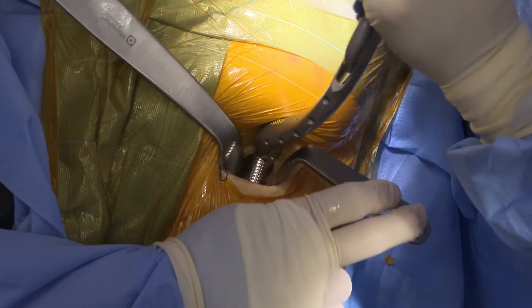The straight anterior approach is already good because we're not cutting any muscles, but in order to get visualization to prepare the acetabulum and then prepare the femur, we had to make a fairly long incision down the thigh. By using the cannula, the distal half of that incision we don't need anymore because we're using a percutaneous route through the subcutaneous tissue — so we save that incision and save muscle dissection. You can make your incision in a spot less likely to involve branches of the nerve we're trying to preserve, and it allows us to see the femur better so we can still do all the same releases, just in a better way, and insert our broaches and stem in a much more favorable orientation.